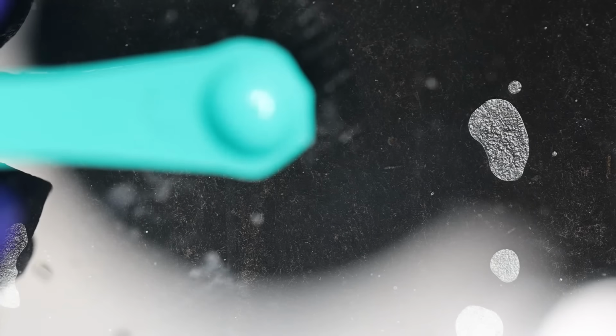Okay, so over here we will place this MTA powder, and how much MTA powder we need is just a scoop. So we will take a scoop of this MTA powder.